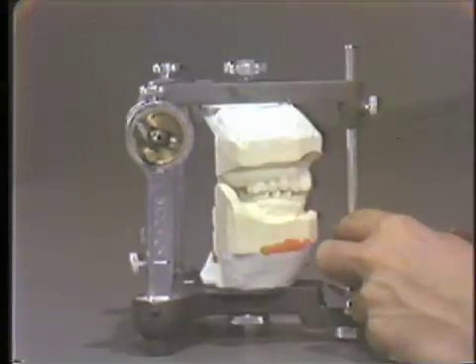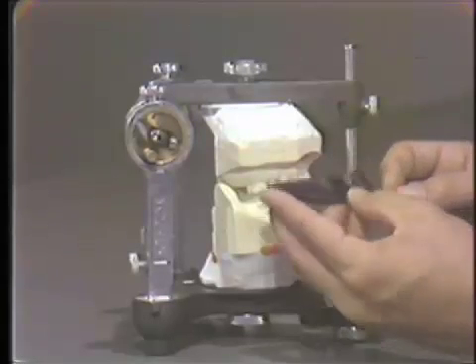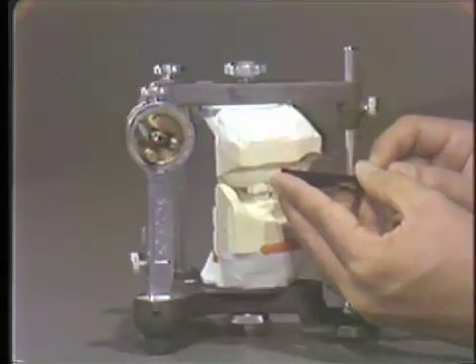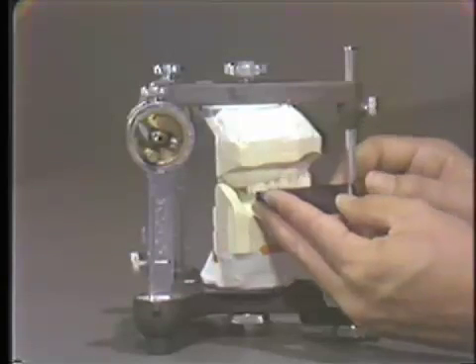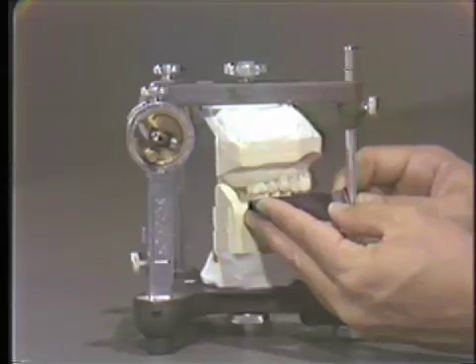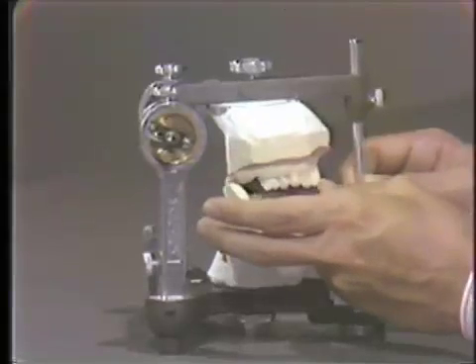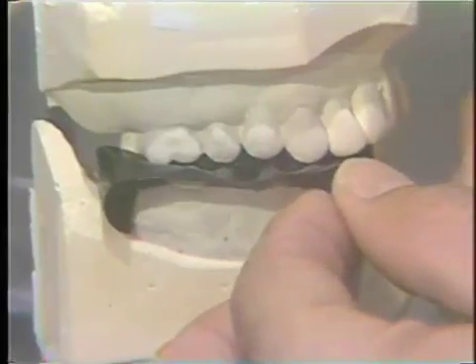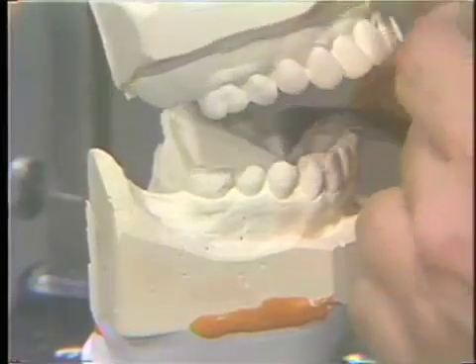The indicating material I've used in the occlusal analysis is a very thin film called AccuFilm. It is thinner than articulating paper and it marks only on one side, so when I do the analysis here, we'll have to mark both sides. This is just to repeat that first arcing in the centric relation and registering the entire slide from centric relation to centric occlusion, and I'll do this bilaterally.